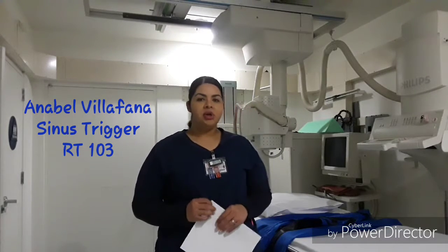Demonstrating my sinus series, I am going to be doing a lateral of the paranasal sinuses, an axial, which is our Caldwell method of the frontal and anterior ethmoid sinuses, the parietoacanthial projection, which is our Waters of the maxillary sinuses, and the SMV projection of the ethmoid and sphenoid sinuses.